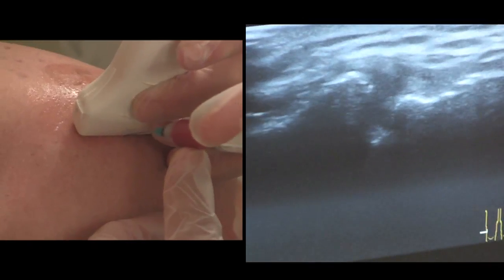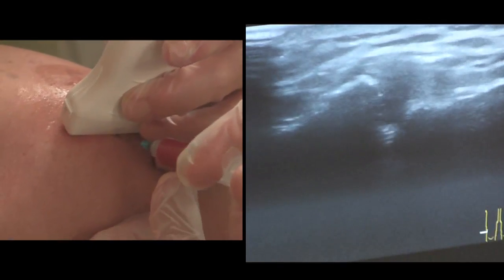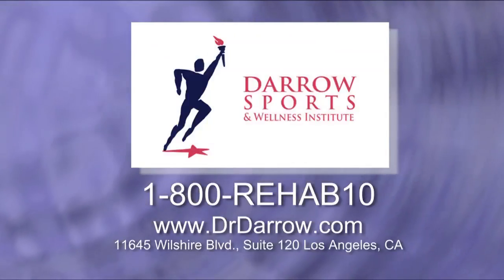This is a 38-year-old male whose shoulder dislocated last year. Although it has been suggested this patient undergo surgery, he is an excellent candidate for PRP to heal his pain.